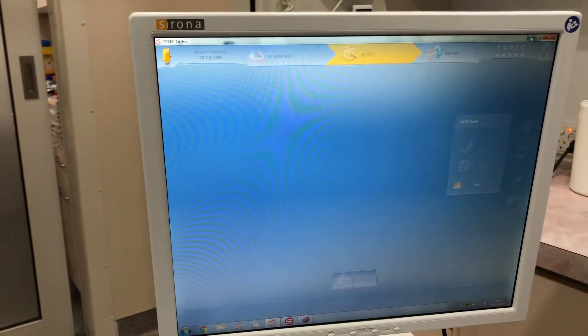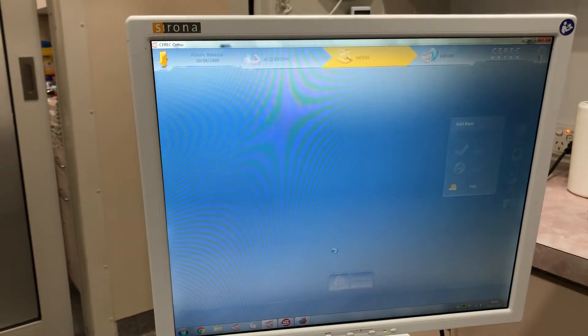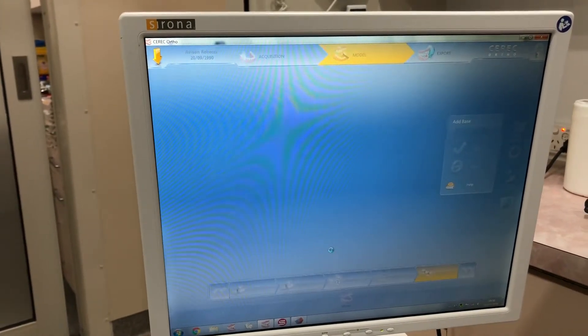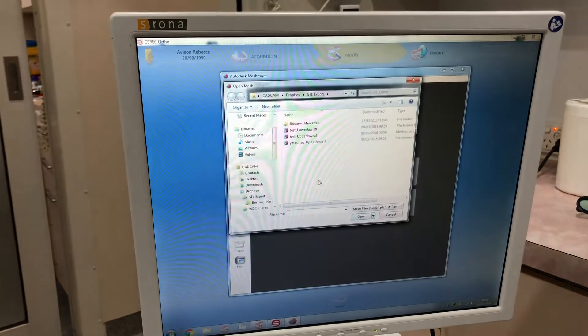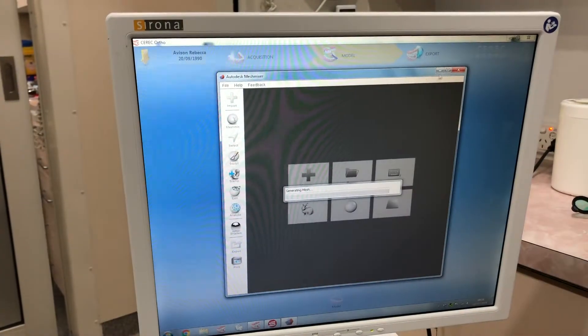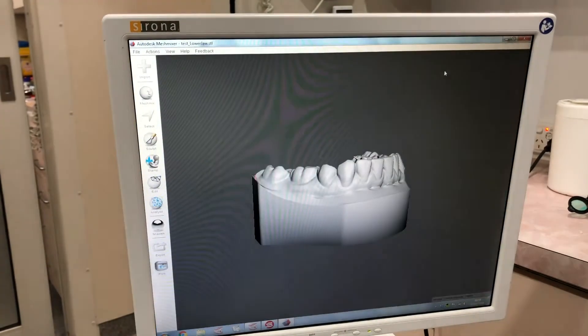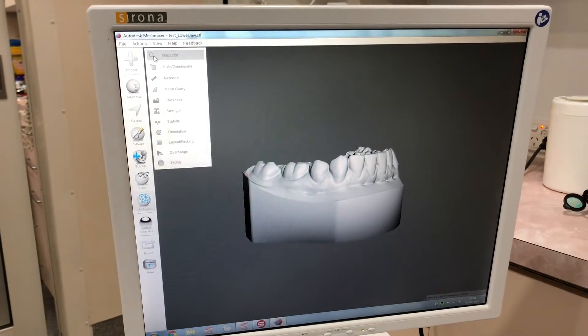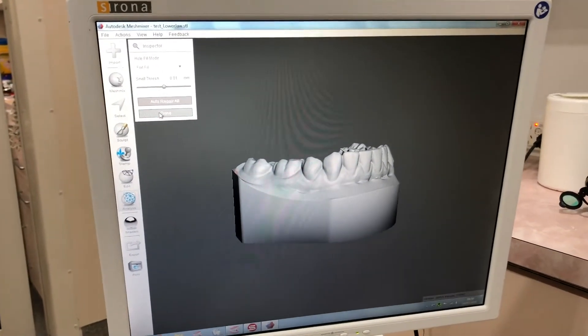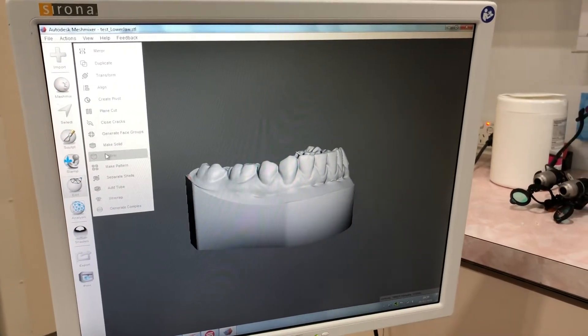You can print the base as is as a solid model, but it's going to take a boatload of resin, so the best thing to do is hollow out the base in Meshmixer. Even though Cerec Ortho exports a solid model, I tend to use the inspector to check for holes, just in case.